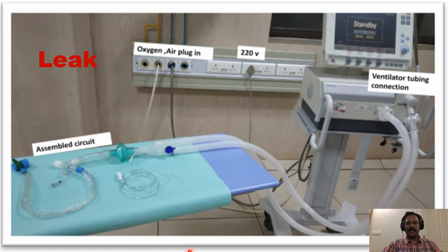So in the ventilator circuit, we are having a lot of areas for leak because a lot of connections are there. You have to check your ventilator tubings at the ventilator end. Check all the ports, including whether the MDI port is working properly or whether it is open or having some leak. Check your ETCO2, check your filter, whether any breakage is there, and make sure that your assembled circuit is working properly, especially the closed circuit.